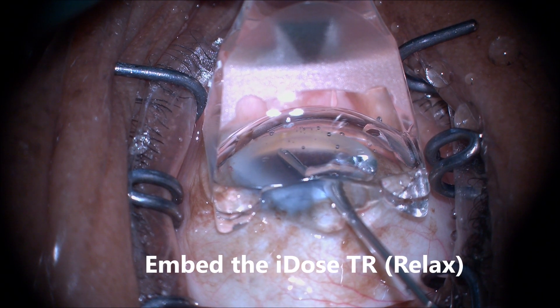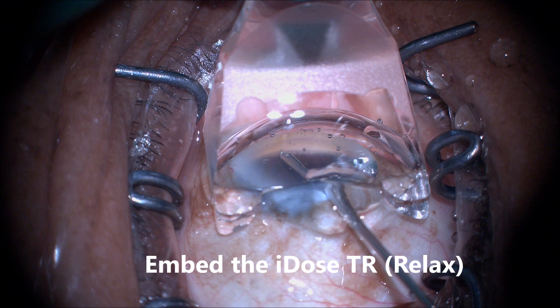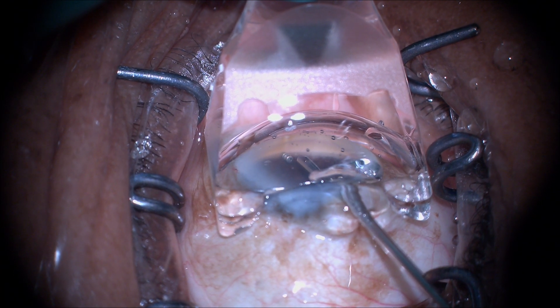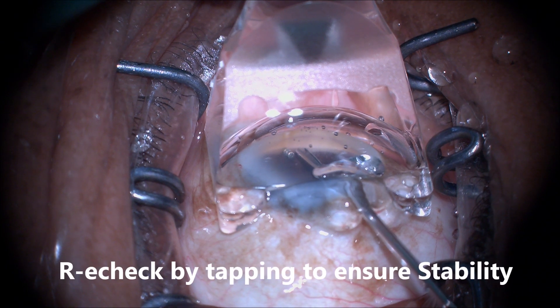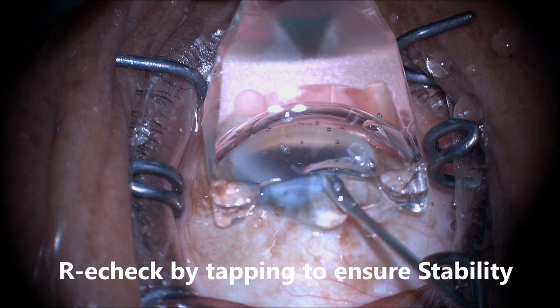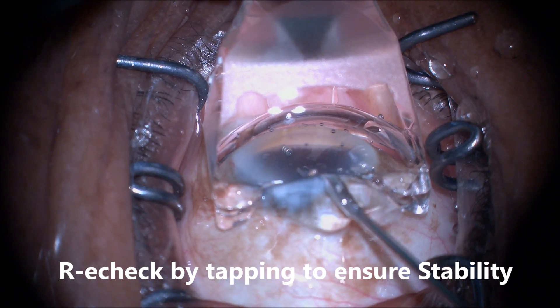Now it's time to embed the IDOS-TR by relaxing release pressure on the inserter and sliding the release button backwards. Once the IDOS-TR is free and embedded in the scleral wall, you want to recheck by tapping to ensure stability.